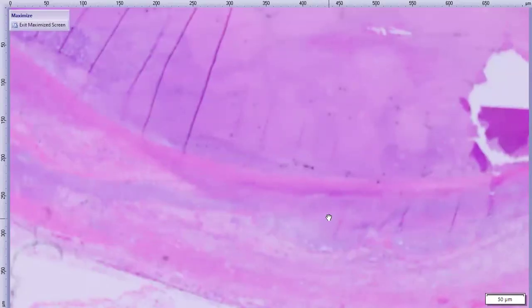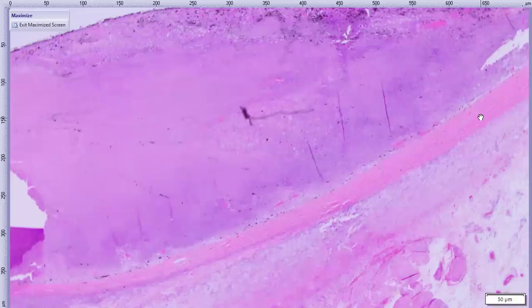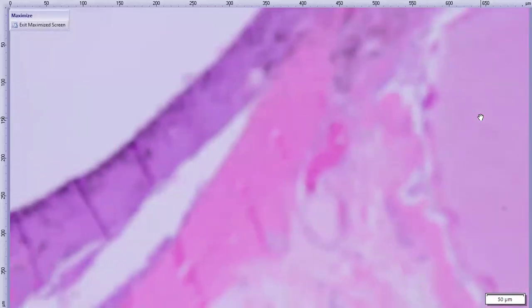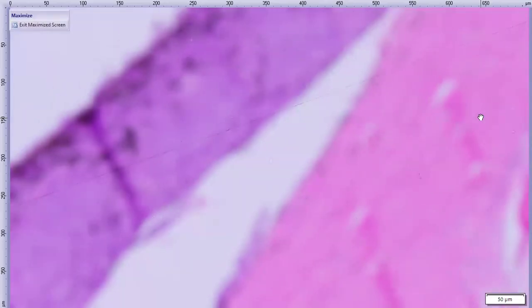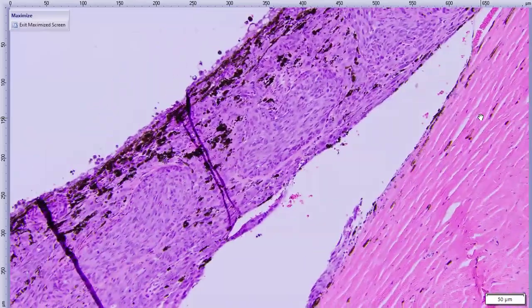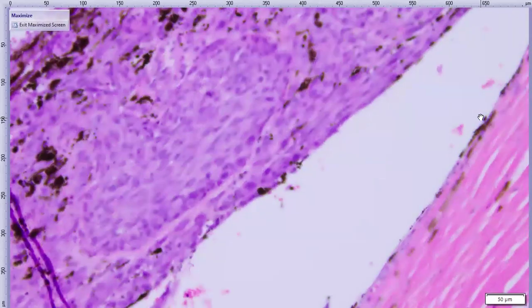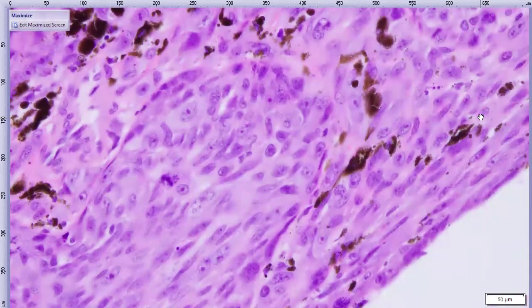So there are vast areas of necrosis. All of these areas where it's more pink than purple are just areas of necrosis. They're not that exciting to look at higher magnification because the cells don't have any structure anymore to really try to evaluate. So we can move back here into the choroid, and it's a similar story to what we were looking at first, where the neoplastic cells are spindle-shaped. Once again, they are in choroidal blood vessels here and spilling out into choroidal stroma.